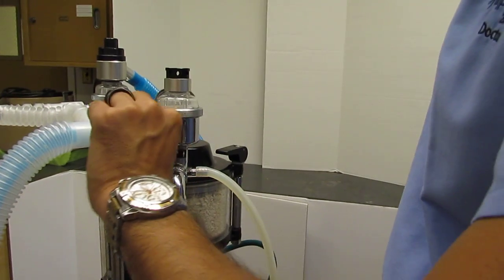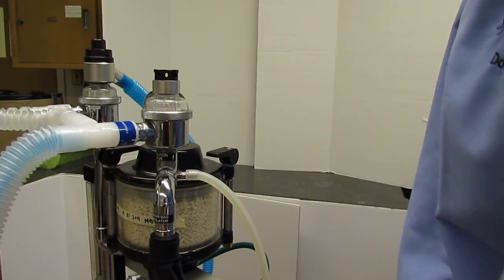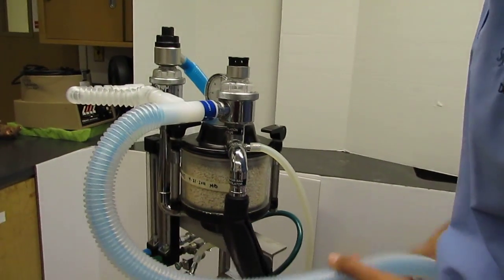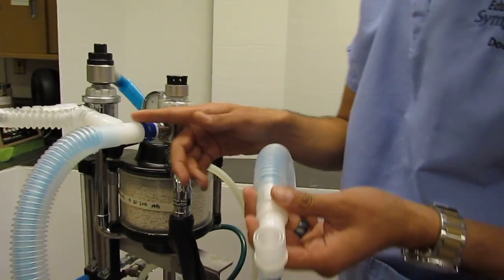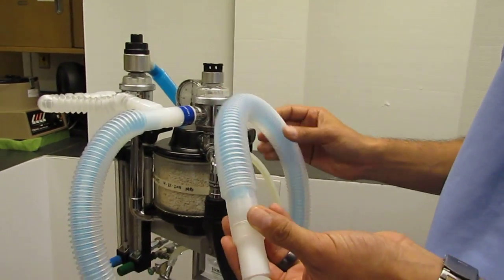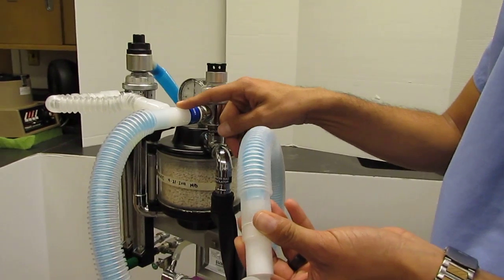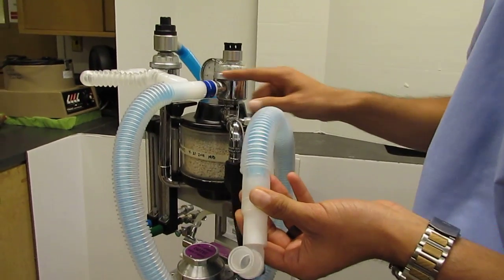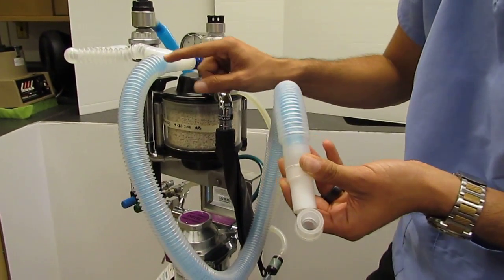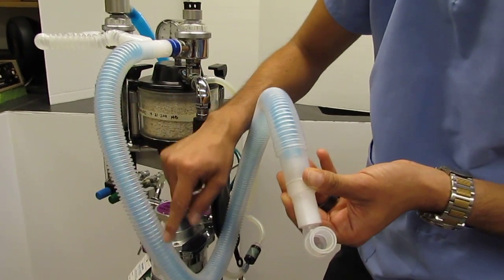From here, the one-way inspiratory valve sends the anesthetic gas and oxygen mixture in to the patient, via this coaxial Bain circuit, this is a rebreathing circuit, and we'll talk about circuits in a separate video, but this is a rebreathing circuit, the inspiratory air is going through the middle tube.